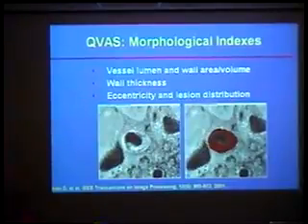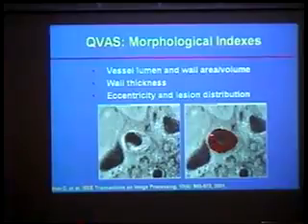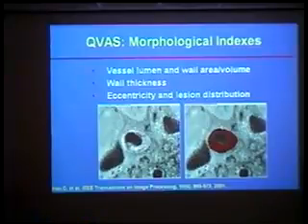The idea is that if you can get a lumen boundary traced, and an outer boundary traced, this algorithm can automatically give you the wall thickness, where the maximum thickness is and the minimum thickness is, and also the mean across the entire artery. And the nice thing about this algorithm is that it is not dependent on the size of the lumen and the outer wall boundary. They could be of arbitrary shape.